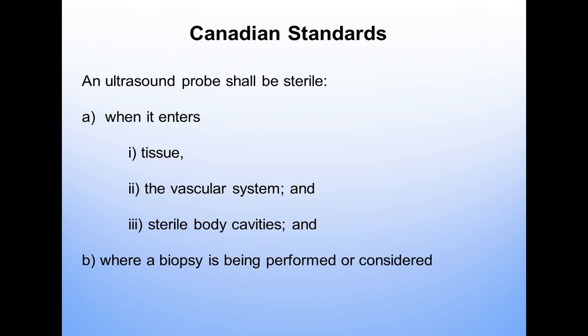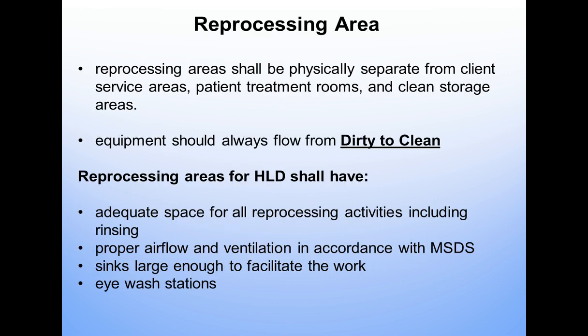And I know in my acute care setting where I just recently retired, that was something the IPAC group were going to be looking at, because we know in the emergency departments the probes are being used fairly widely in those areas, and they do come into contact with blood. And so it's important to make sure that we're following those guidelines.